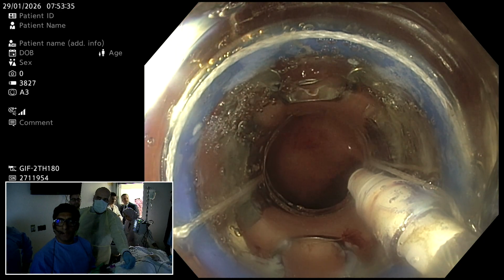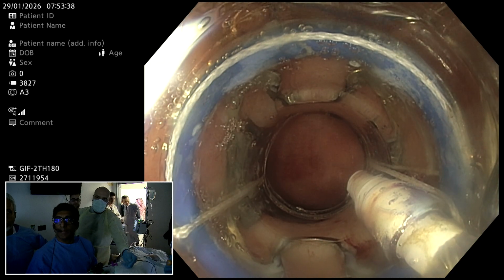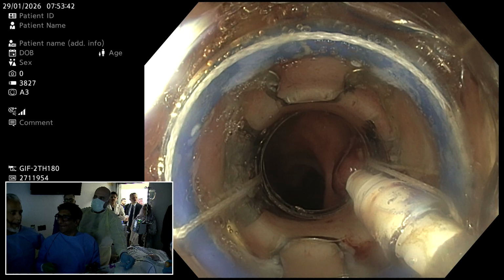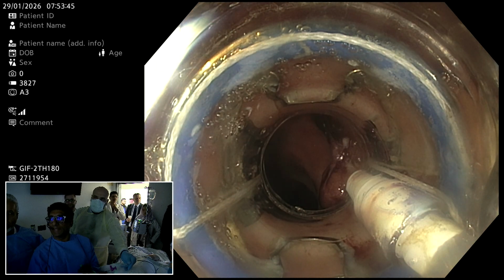You can see here I am going with a cap, and I have with me Sham from Muscat. Yes, hello, hi, how are you? And so you can see here he will guide me.